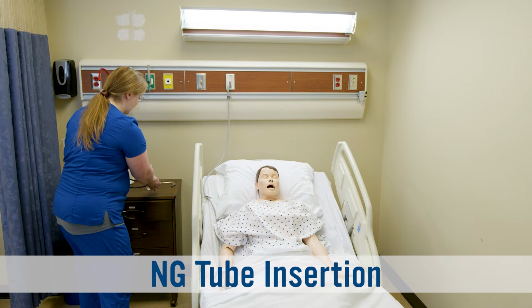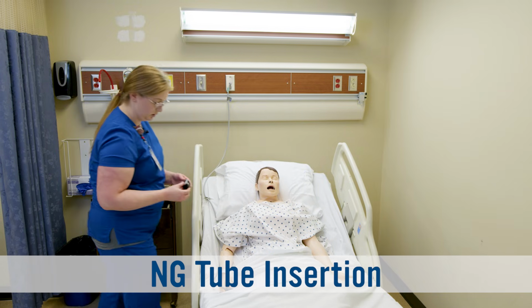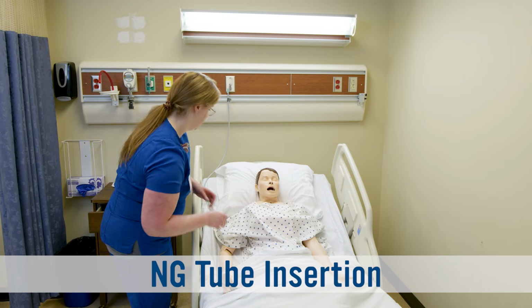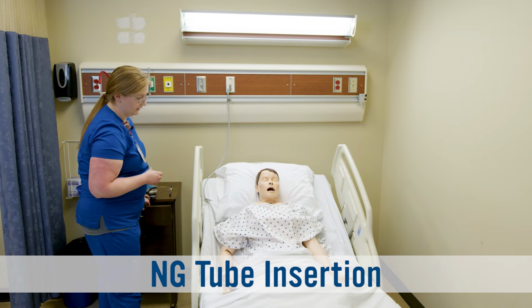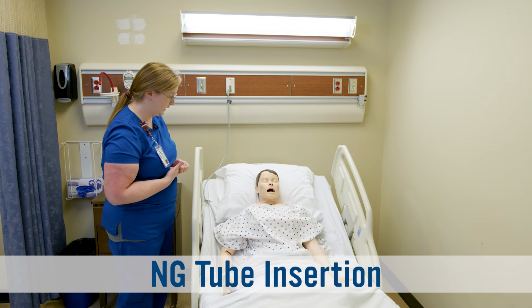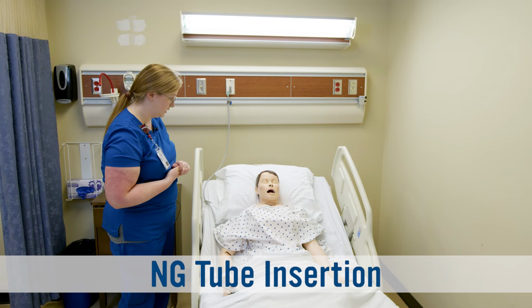I'm also going to go ahead and do a set of vital signs. So I'm going to check your pulse ox, respiratory status, your blood pressure, your heart rate, temperature, all the things. Okay, so now that we have your vitals and your assessment done, I want to talk to you about the procedure that the doctor has ordered.